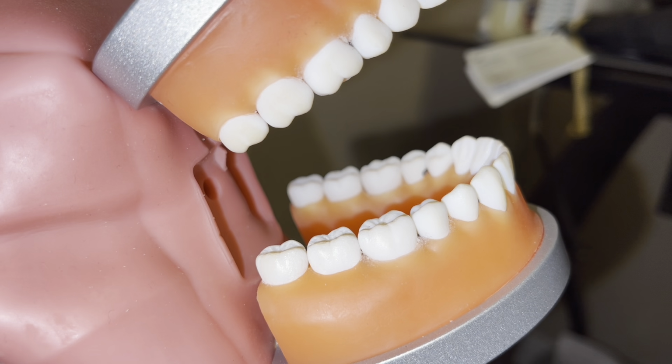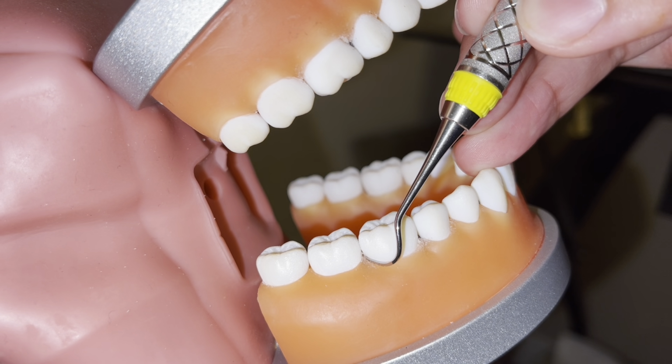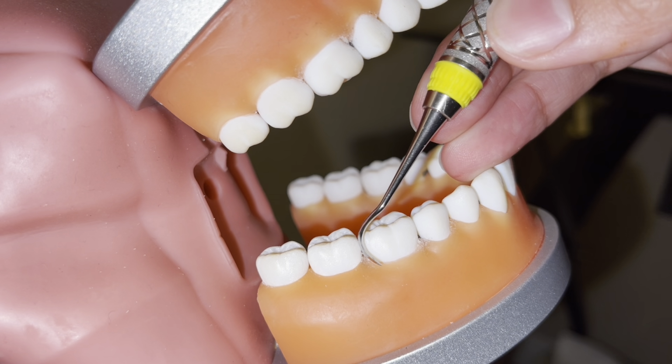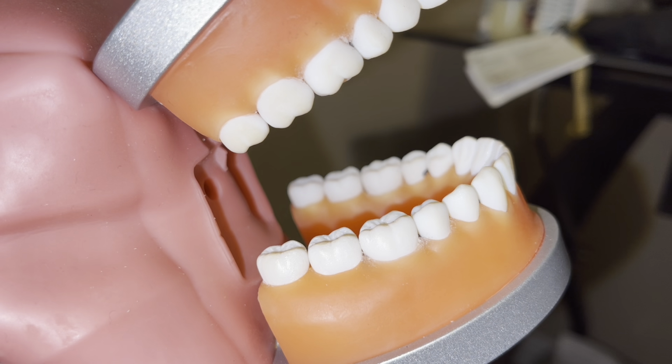Hello, so for this video, I will be scaling teeth numbers 29 and 30, buccal and lingual aspects, using my sickle scaler. I want to make sure that I am using the correct end, making sure that it wraps around the tooth like so. Using the wrong working end, the tip would point away from the tooth. I'm sitting at the 8-9 o'clock position. My patient is in semi-supine and slightly away from me.